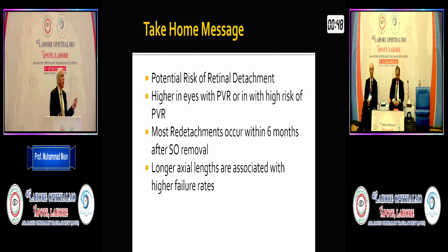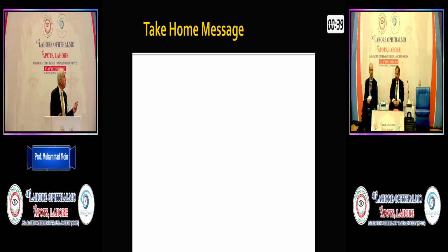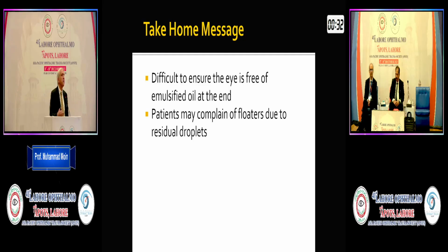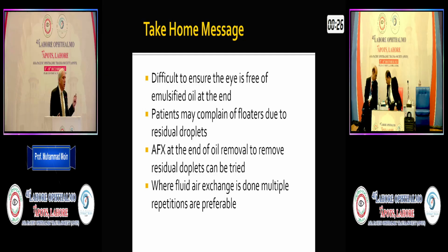And longer axial length or myopia is associated with higher risk of detachment. So prophylactic 360 laser is usually essential before you are going to remove an oil. It's sometimes difficult to ensure that the oil is completely removed at the end if you have a free emulsified oil. So that's why you can do multiple air fluid exchanges to remove that oil, and this can be done.